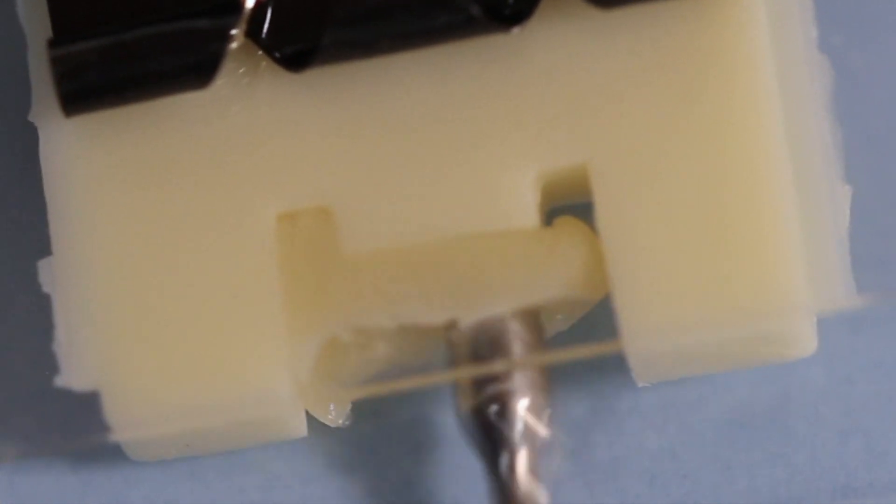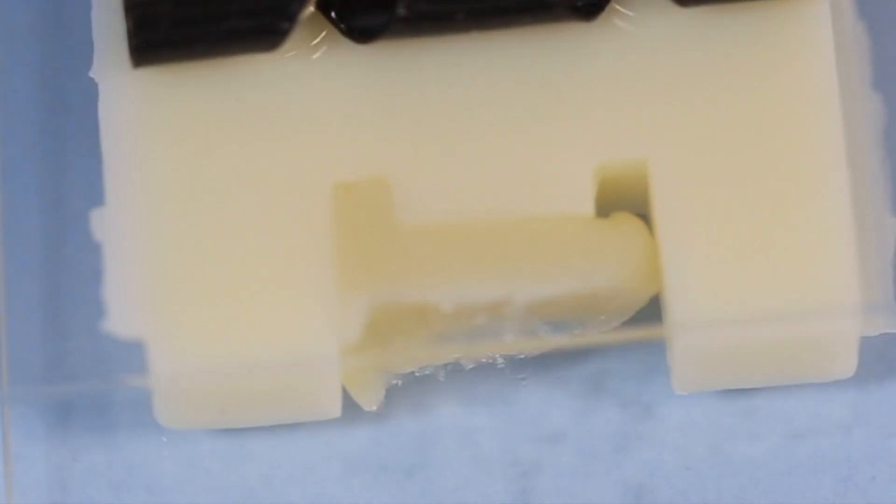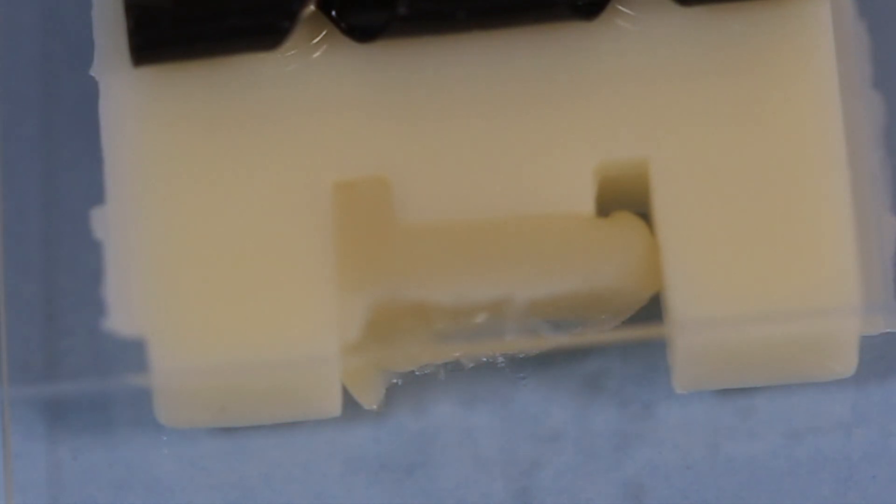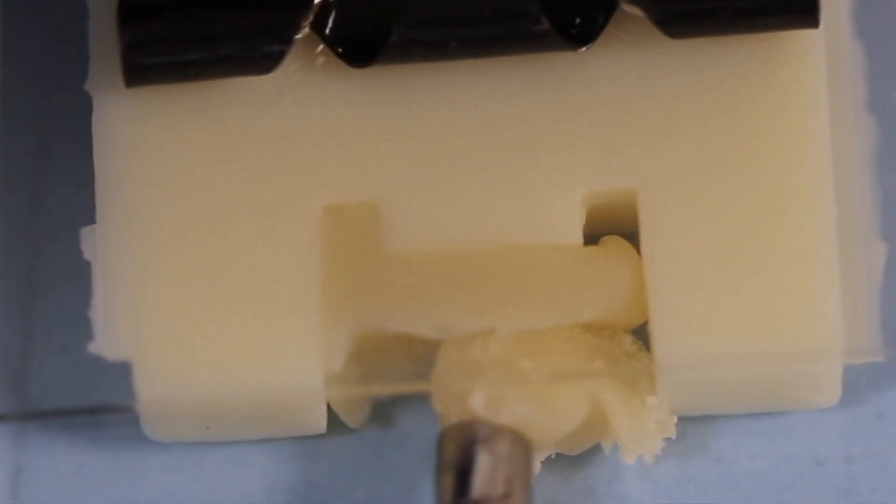And again, it is heated and you can see that when you put it in, the composite does adapt fairly well, but it's already now starting to cool down.